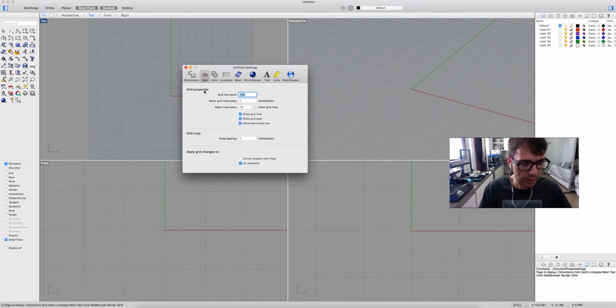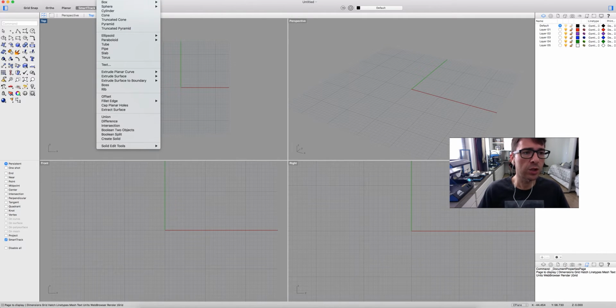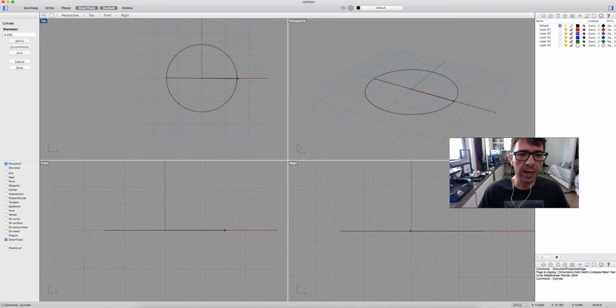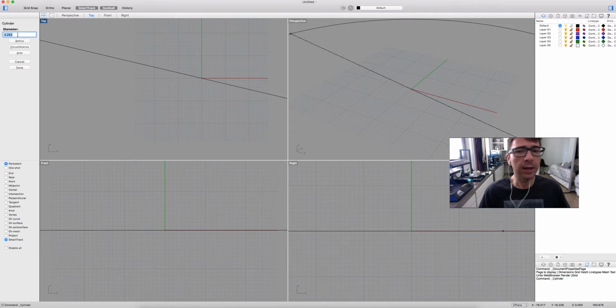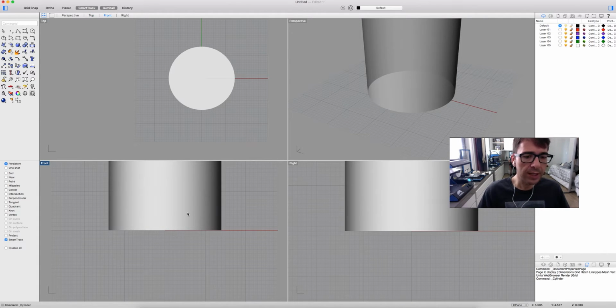We're going to choose 28, which is the diameter of our baseplate. So here we have a 28 diameter. We are clicking on solid and creating a cylinder. We select the central point of the cylinder, and now we can choose the diameter. We can draw it by hand, or right click and set a 28 millimeter diameter. And now we just need to do the offset.